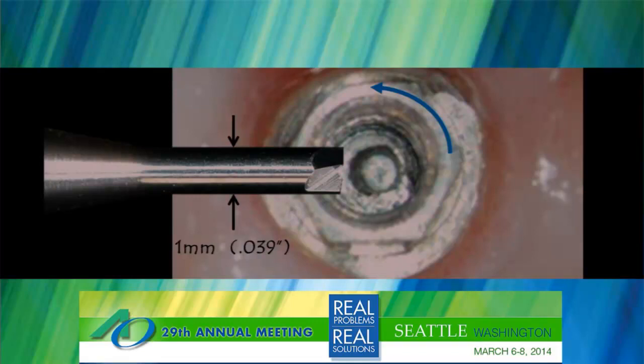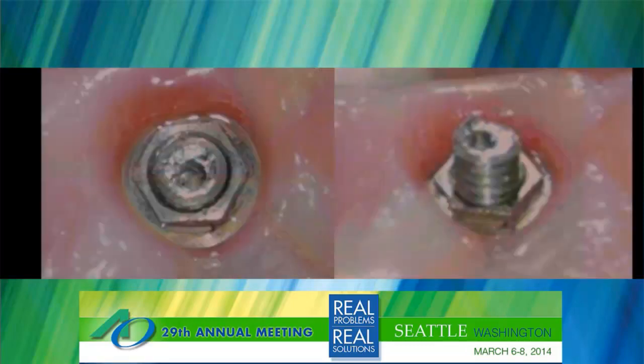But that leaves 8 thousandths sidewall, and so by the time you put the fragment fork into this hole, it wedges itself into that hole, and then with a reverse counterclockwise, lefty-loosey turn, it will affect removal torque. But it's guided, because the center hole on that fragment is guiding the fragment fork in there, and you're staying away from the threads.